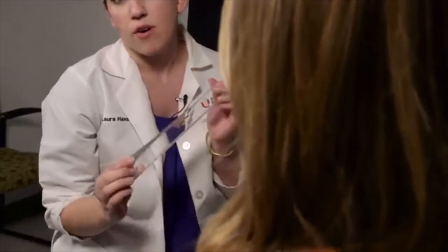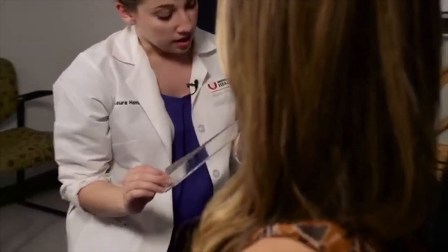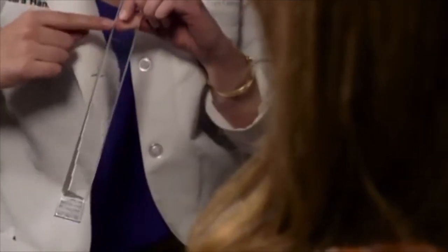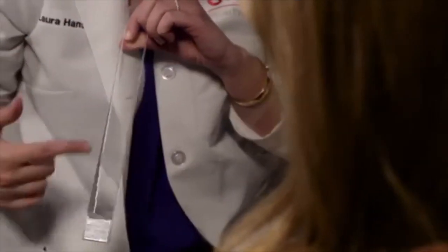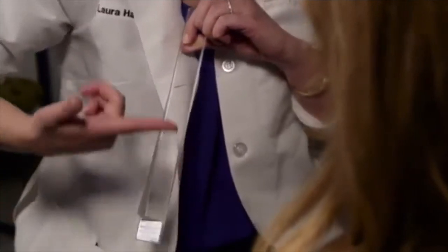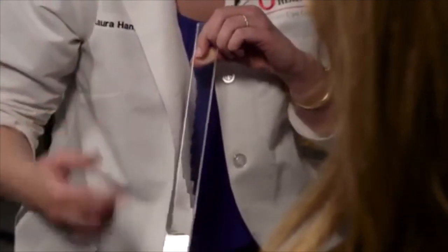This is a Prism bar. This is one of the tools that we use in neuro-ophthalmology to measure deviations. Kind of makes it fast and quick. This is a horizontal Prism bar. You can tell because the base is oriented out to the side. In a vertical prism bar, the base will be oriented on the bottom portion of each prism.